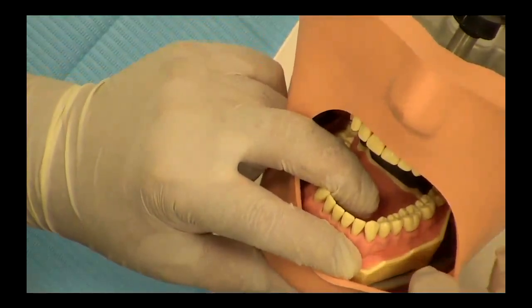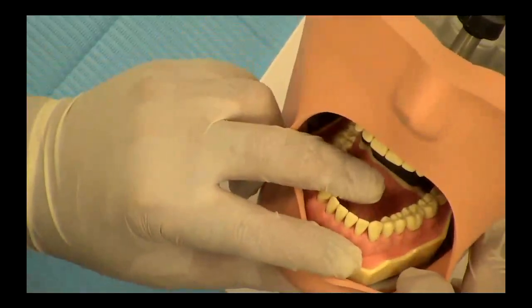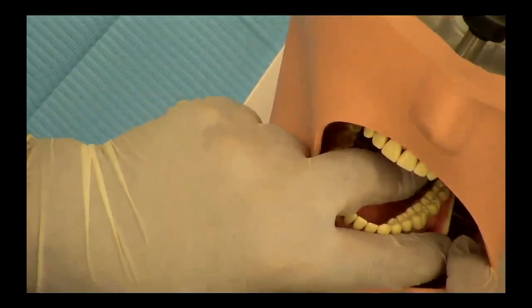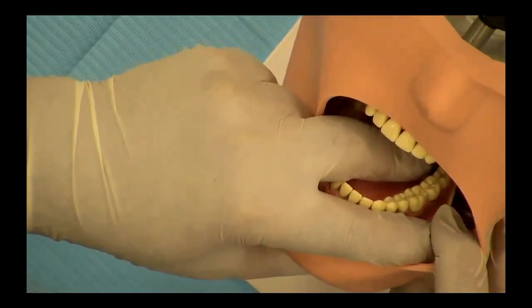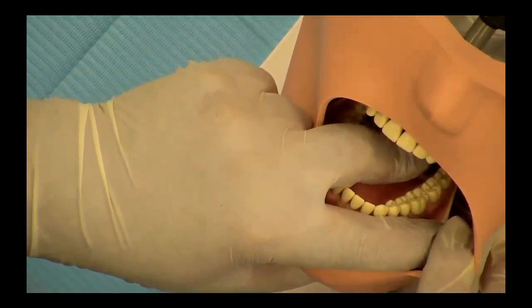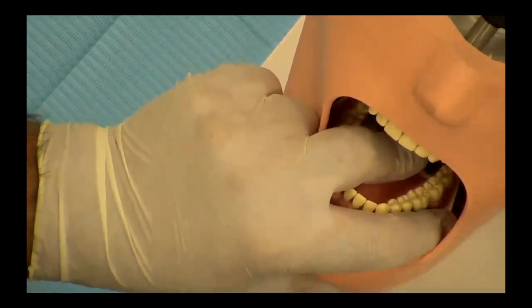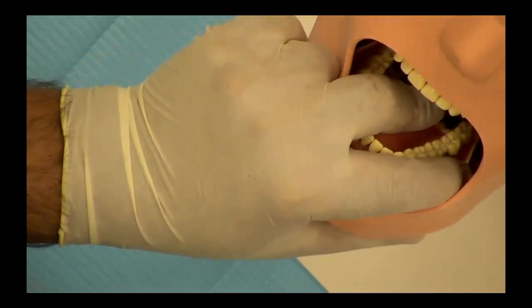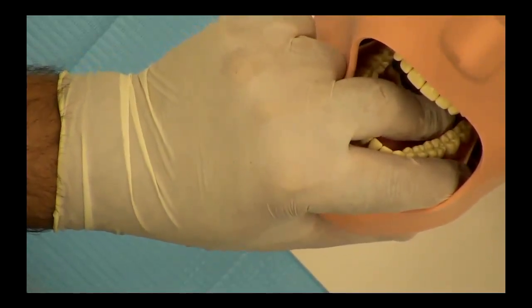For the mandibular left quadrant, simply slide across, and you will have your middle finger on the lingual side, forefinger on the buccal, and your thumb supporting the mandible. I'll just lift it so you can see. Thumb supporting the mandible.